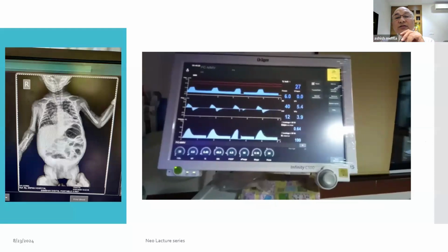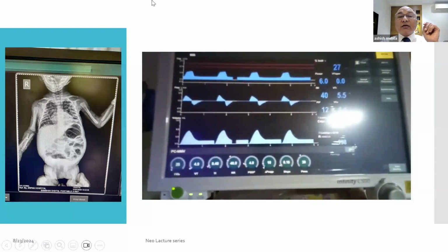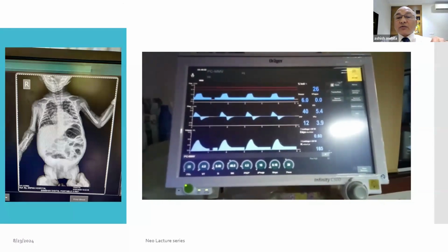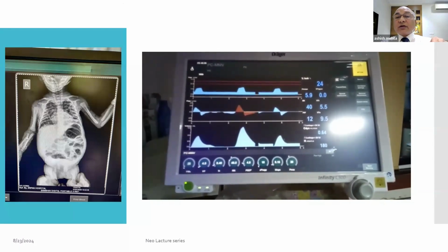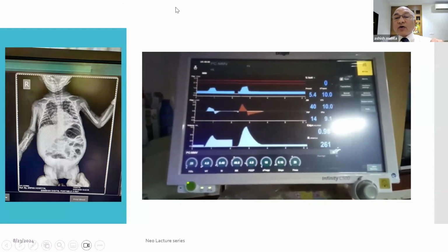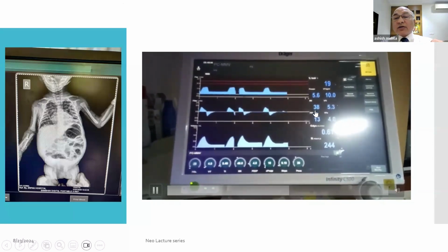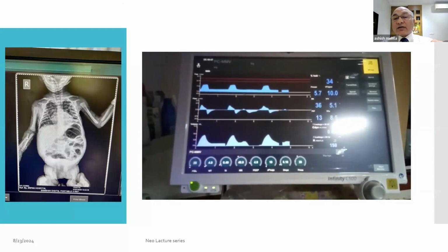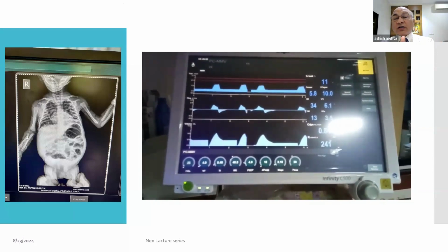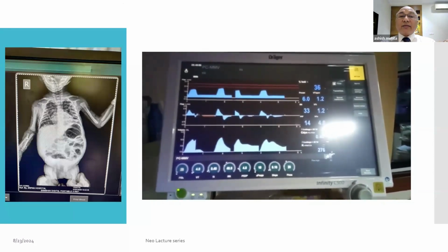And that is what you can see here, this is a patient. You can see above SIMV plus PSV plus VG, you can see on the top. And this baby was put on MMV. You can see the PIP, hardly 5 or 6 is going. The rate is 40 at the moment. Baby wakes up, the automatic weaning on the rate starts. You can see 38, 37, 36. And when the baby goes to sleep, again it goes to 40. So automatic weaning of the rate is happening with the MMV mode.